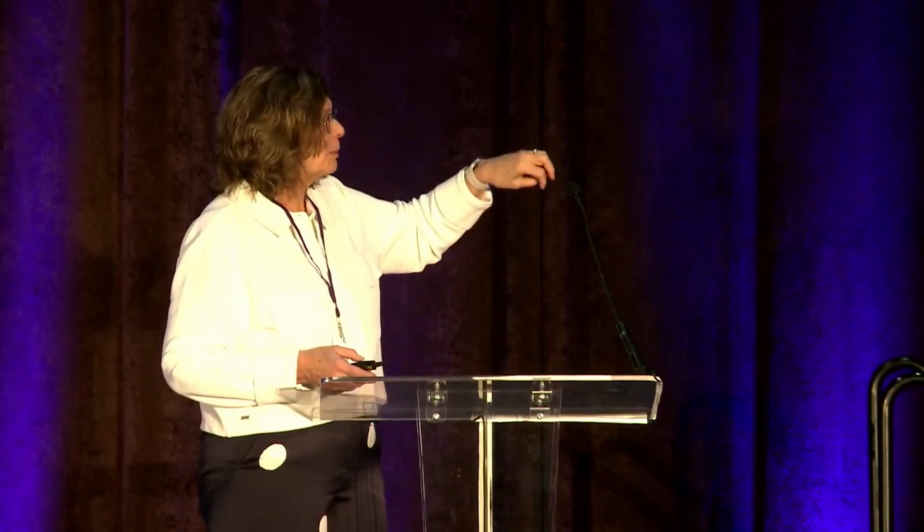And the most common congenital abnormality, as we heard, is the bicuspid aortic valve. That can only be seen on this picture. We turn the probe, and this is actually still a 3-leaflet aortic valve. Everything is marked here. The P is the probe up there, and this is a regular transthoracic, not a transesophageal echocardiogram.